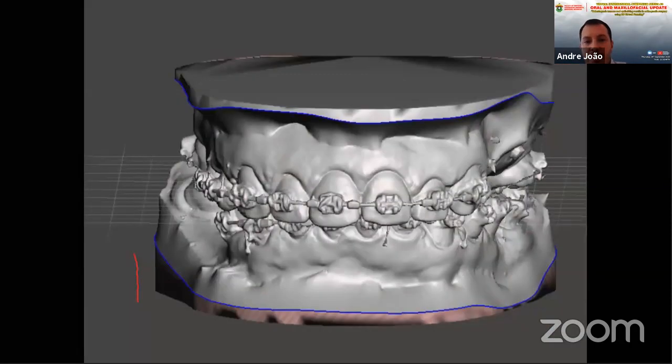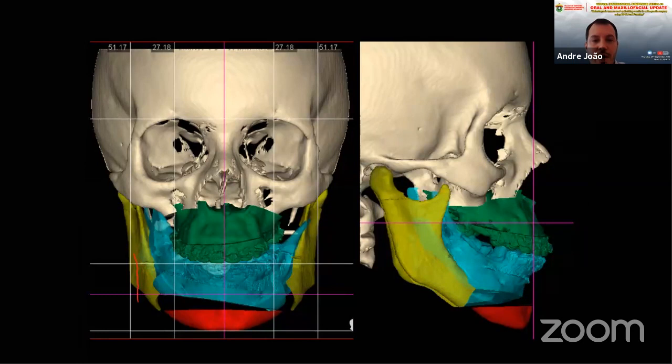And if I follow my plan, correcting both bones and placing them in occlusion, I would end up with this mandible here, completely asymmetric. Movements that had a lot of bone interference. Look how the bone would end up after surgery. And then I realized there is something wrong here.